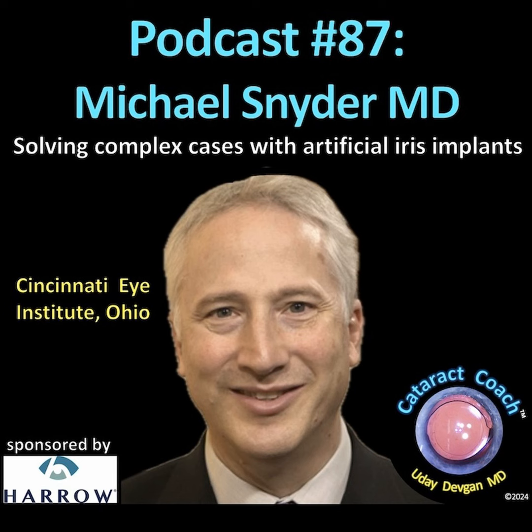However, an interesting thing about the eyes that have a custom iris in place in the bag is that the iris device is made of silicone. And so the capsule doesn't stick to it at all. Oh. And so it's actually rather straightforward to repair these. We basically just place 2 Ahmed segments into the bag and suture them to the scleral wall.